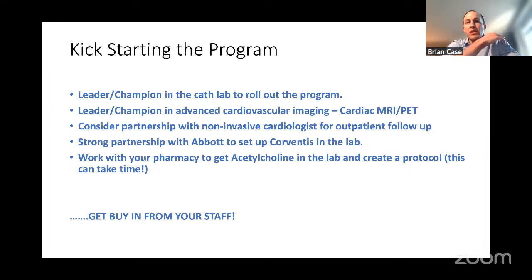And then, which I love, is if you do a left heart cath for whatever reason and the coronaries are normal, your team will challenge you and say, hey, why aren't you going to do coronary functional testing on this patient? And then they love it. They love to see the patient get their diagnosis and the positive impact that we can have on patients. So get the buy-in for your staff for sure.